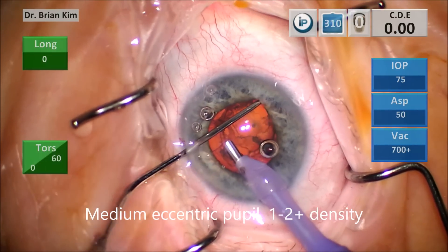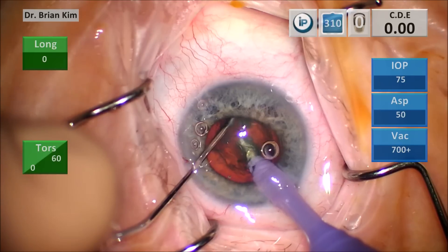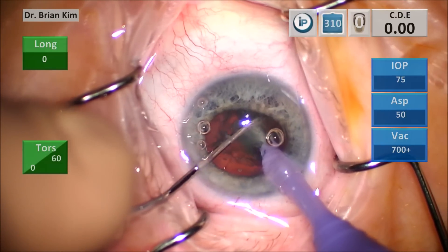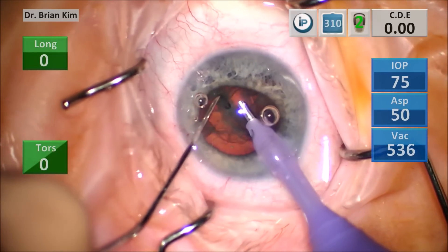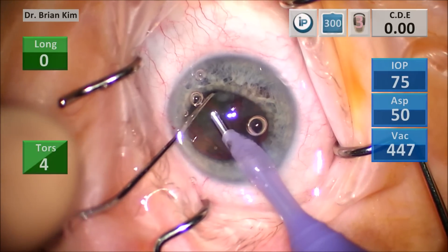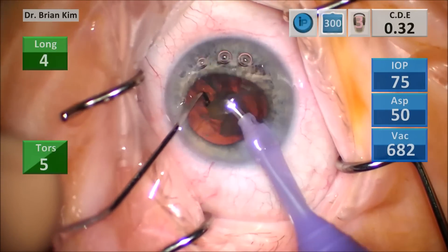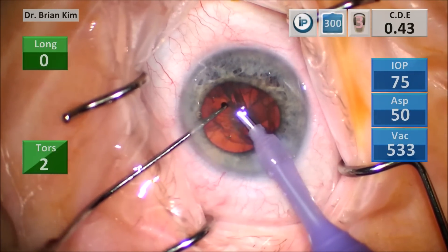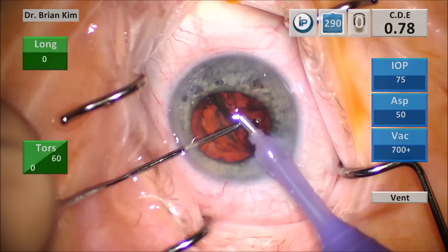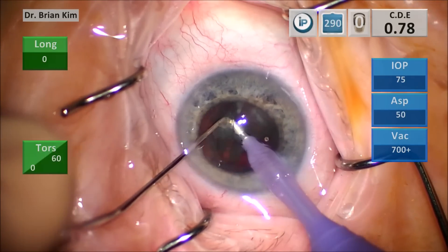Position zero: chopper goes out, FacoTip goes under, bring the two pieces together, break the lens in half, grab the chopper under the anterior capsule — holding the FacoTip the whole time in the same position — and then create that second chop. The beauty of this technique is the FacoTip is not really doing anything; it's a passive player. I'm using it as leverage to help fracture the lens and simply to emulsify. I like to keep it in the central safe zone, away from the cornea, away from the posterior capsule. I'm using the chopper to mobilize all of my pieces and rotate them so they're more accessible to me — position zero during each of those maneuvers — and then I emulsify.